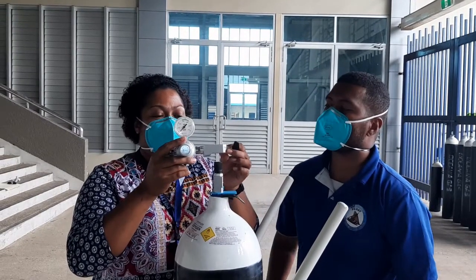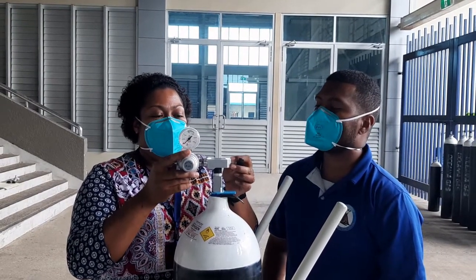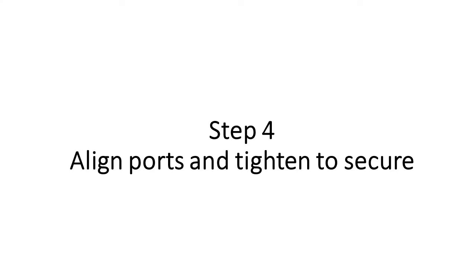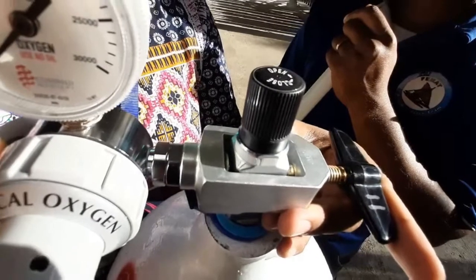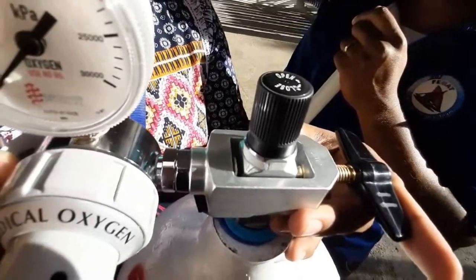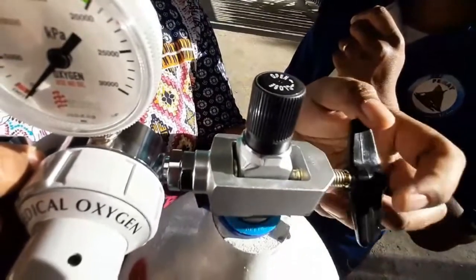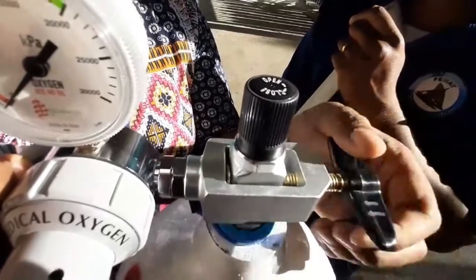We'll slip the pin index regulator over the pin index cylinder like that. Make sure that the ports are aligned. You fit it in properly, and you secure the regulator in place by tightening the knob on the side.